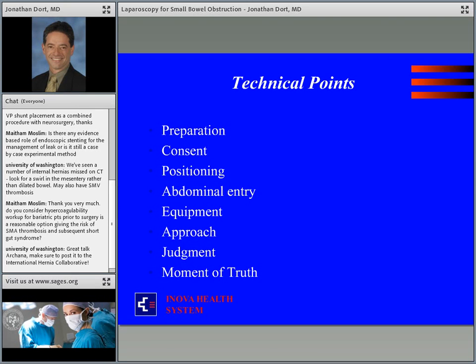Certainly, I would suggest starting in that Trendelenburg left side down so that you can go to the cecum, you can go to the terminal ileum, and work your way backwards towards the point of obstruction. If you can grab mesentery rather than grabbing bowel, that is advisable to minimize the trauma to the bowel. Minimize the amount of energy that you use, because energy in that setting where there's not a lot of room can quickly disseminate and cause collateral damage. And if you can't see through it, don't cut it. It should be flimsy and see-through if you are to cut it.